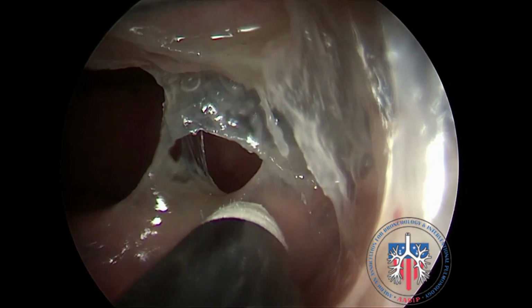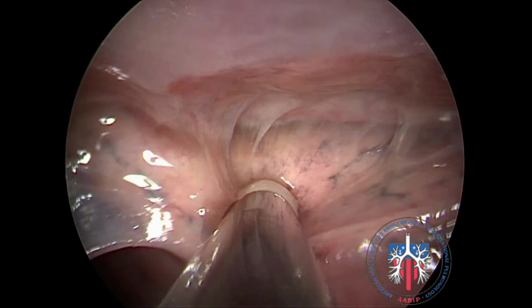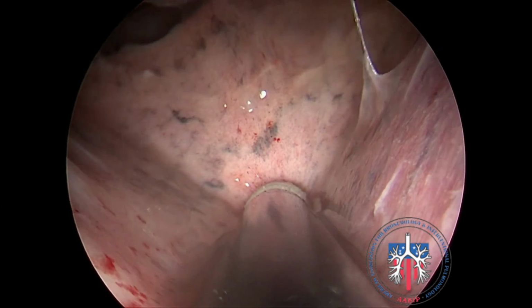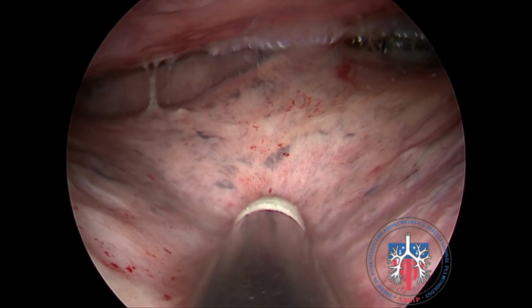Here we demonstrate pleural adhesions. Pleural adhesions refers to the formation of fibrotic bands that span the pleural space between the parietal and visceral pleura. We use a VAT suction trocar to gently lyse these adhesions using a side-to-side motion.